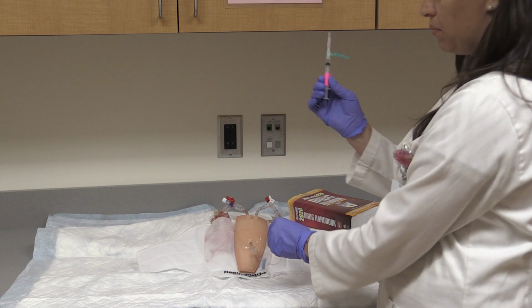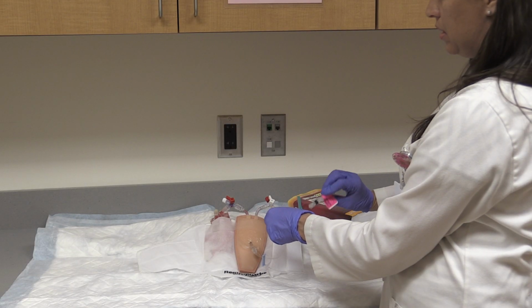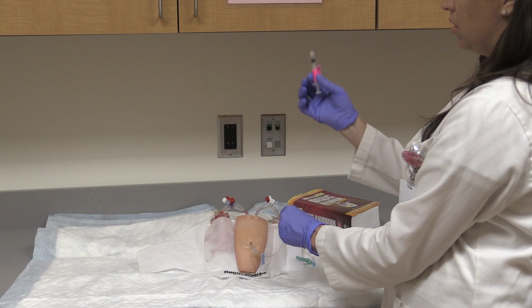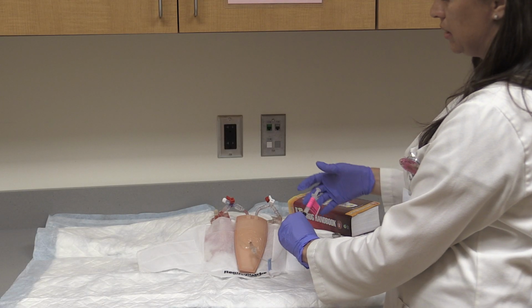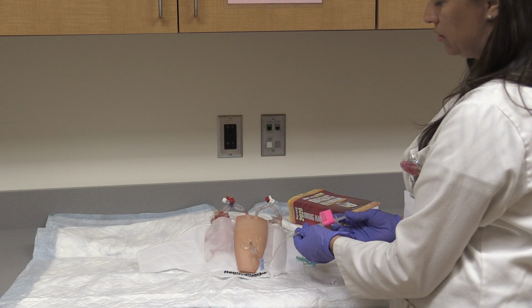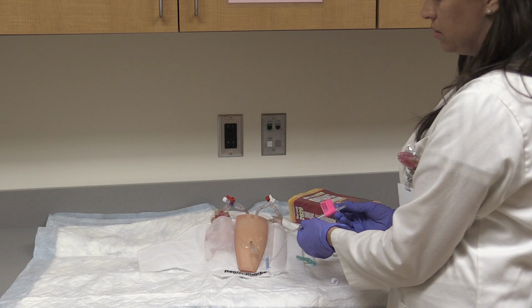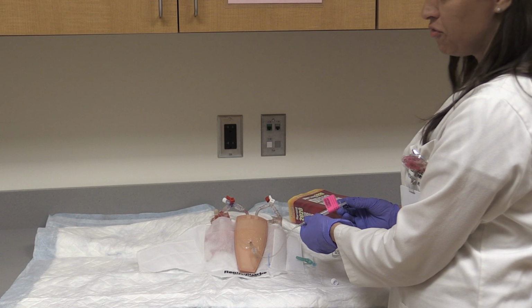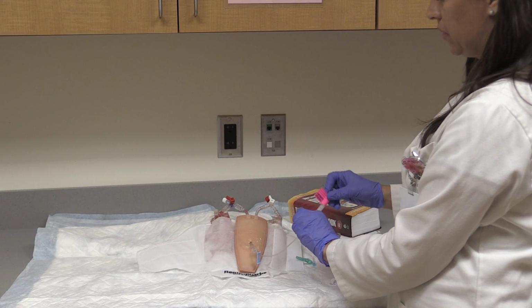And then I'm going to get another alcohol swab and clean the site again. And then I'm going to get my morphine, and I'm going to take the cap, the needle off, and I'm going to attach this to the site. And as we said before, I'm going to give this 2 milligrams over 2 minutes. So magically, 2 minutes have passed, and the morphine is injected.